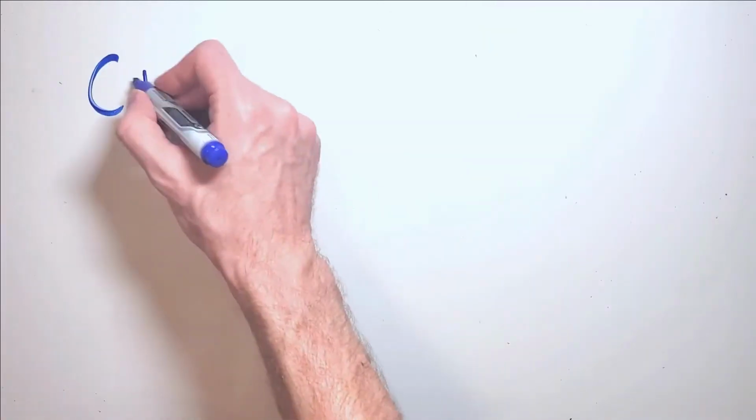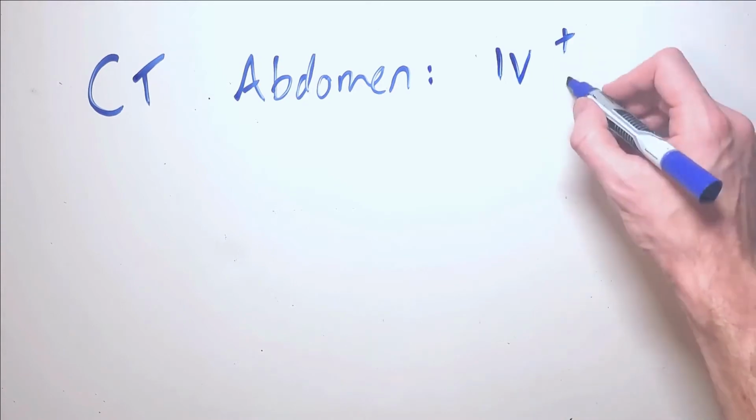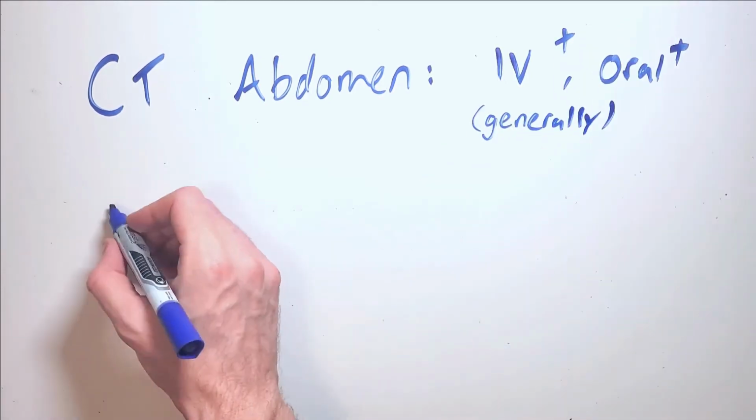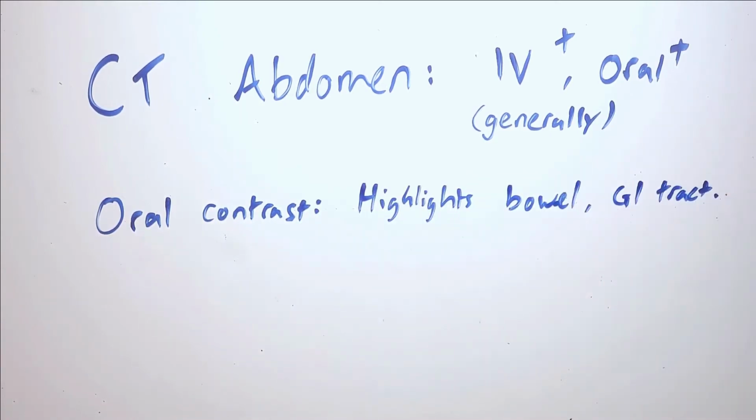Oral contrast is administered often in conjunction with IV contrast to patients undergoing abdominal imaging. Oral contrast allows radiologists to discriminate between contrast-filled bowel and surrounding structures within the abdomen. So the whole digestive tract is visualized with contrast on the scan.